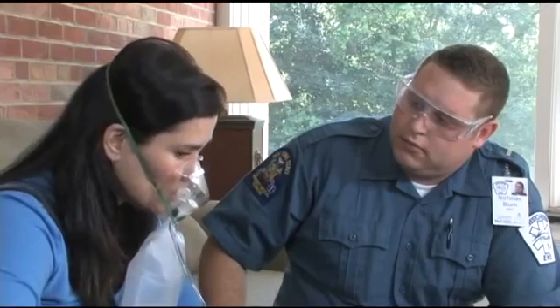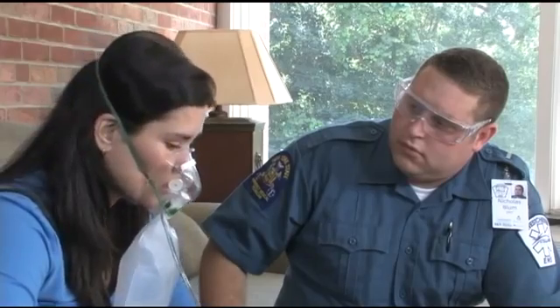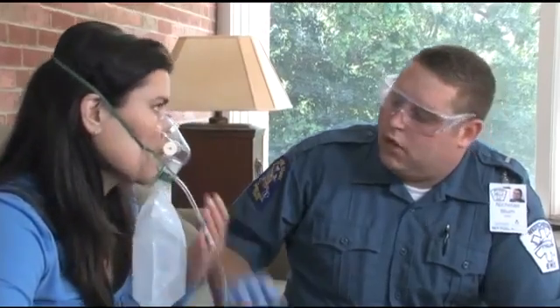Reassurance and encouragement will help reduce the claustrophobia sometimes associated with any oxygen mask. You might also have the patient hold the mask on his or her face, reducing claustrophobia even more.